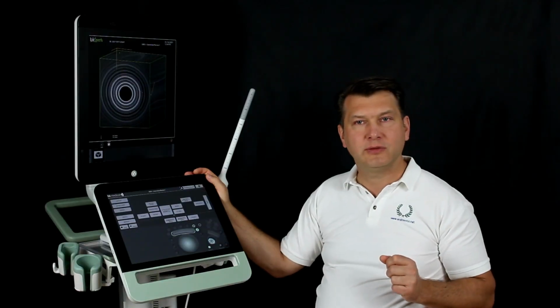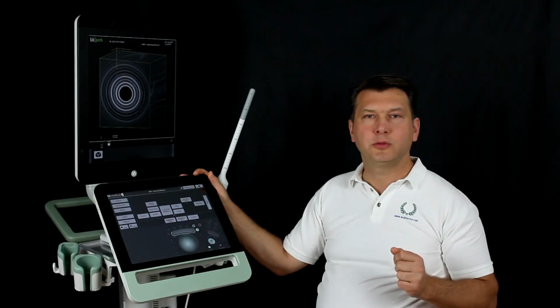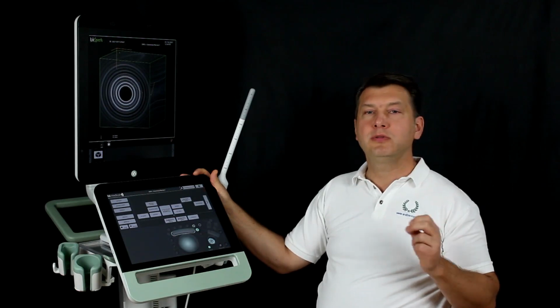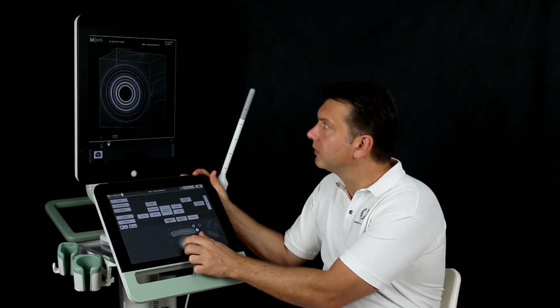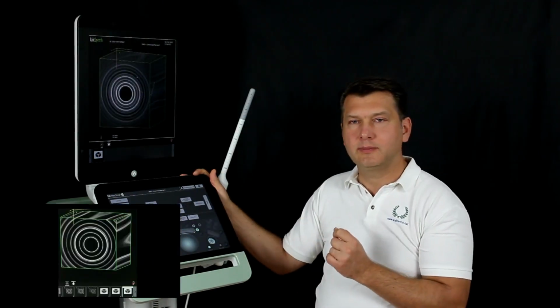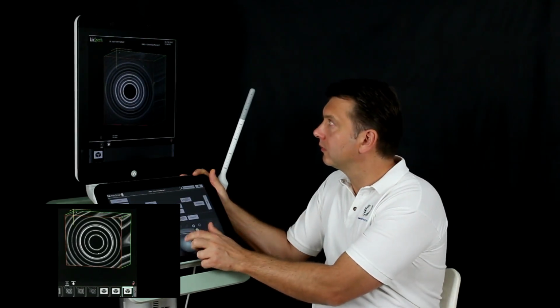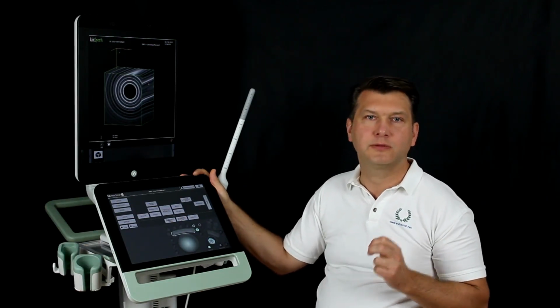We can now enjoy the benefits of 3D recording. In order to extend or enter into every particular plane, we move the cursor to the center of the corresponding plane until this symbol appears. Now we click and push the plane forward or backward. By clicking again, we detach ourselves from this function.